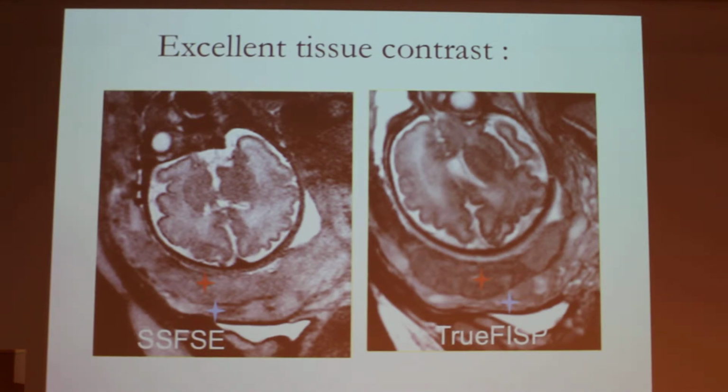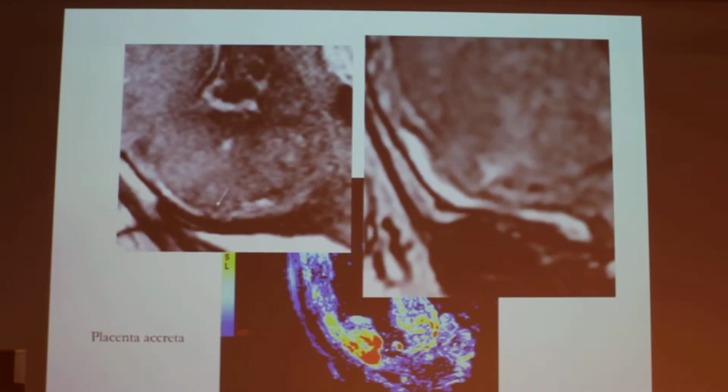Abnormalities of the placental invasion is an increasing issue. You've got more and more cases of placenta accreta and percreta, and those cases carry a high risk of maternal morbidity and mortality. So you really need to use whatever you can use to improve your diagnostic capabilities, and MRI clearly can help you in the diagnosis of placenta accreta.